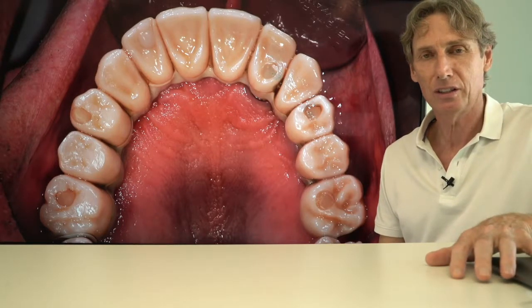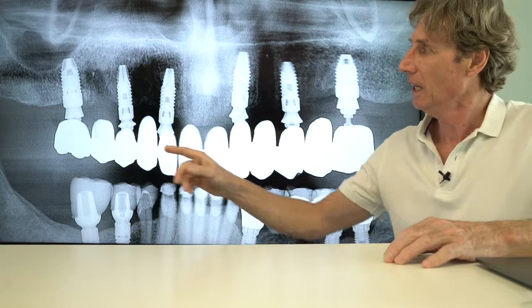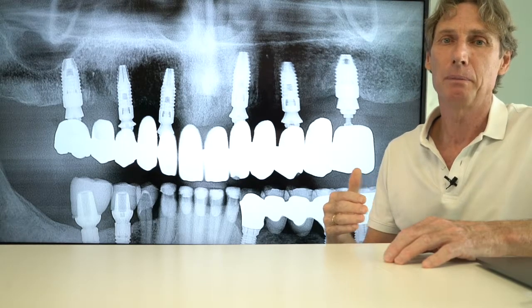And the most astonishing thing is the X-ray image. So this panoramic X-ray was made when the patient came in after 4.5 years for a recall. And we can see this healthy and absolutely stable bone around the implants. And in our paper we showed that this was the case in the other 20 examined patients too. So this might be due to the shock absorbing capability of the PEEK framework.